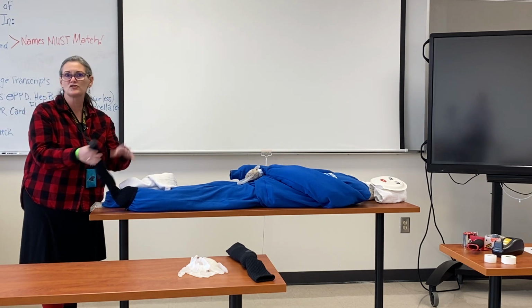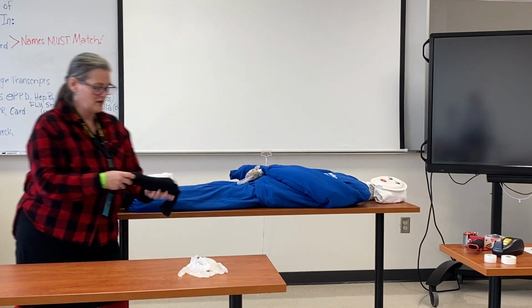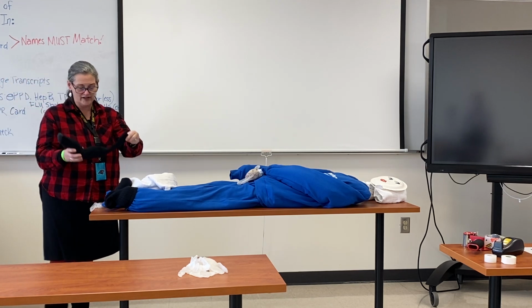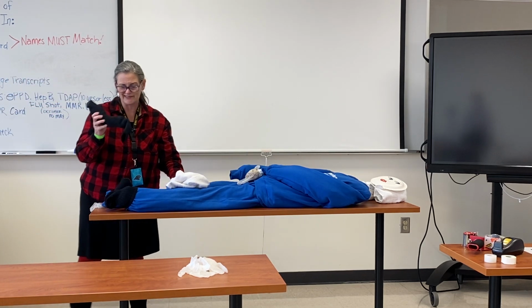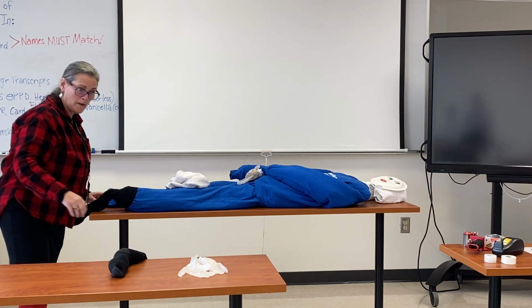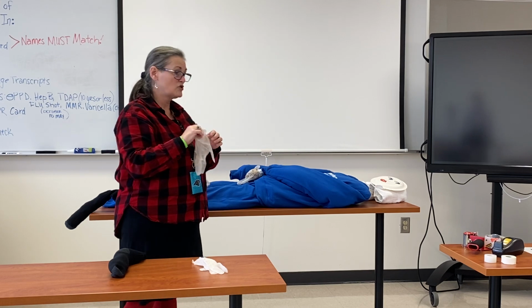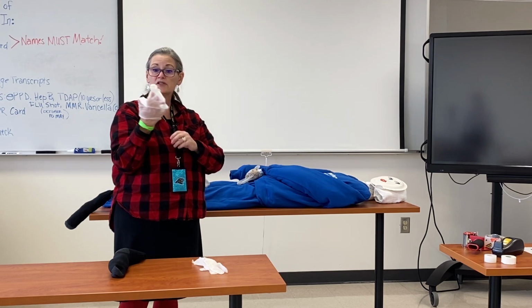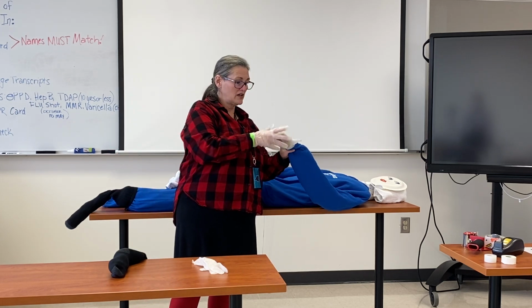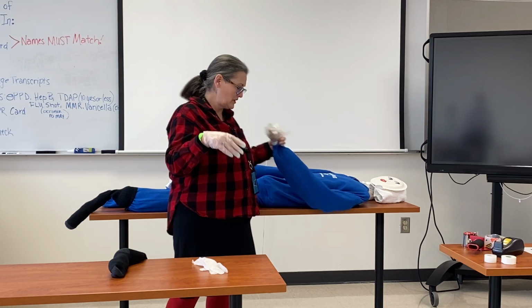So I just real quick stuff some in here. Oh, here's one, sorry. Here's one that has a towel in it. You can see it looks a little more lifelike. So I could put this one on the other leg, but I'm gonna move on. If you have some gloves, okay, you can take plastic gloves. You can also use paper towel to stuff your glove to give Granny a hand, which I've already done here. Again, it's not great, but it's a hand, so we've simulated a hand.